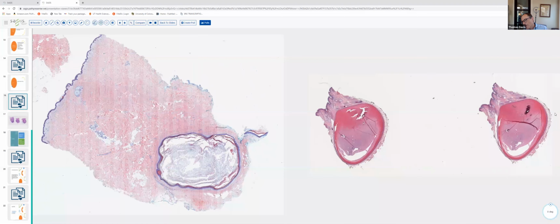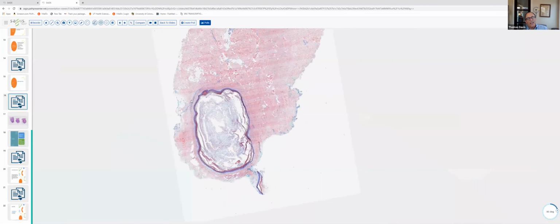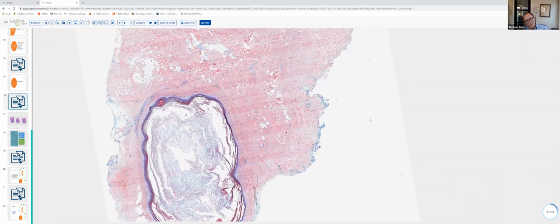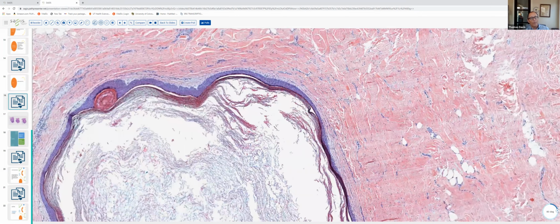On the left, we have a follicular cyst of the infundibular type, also commonly known in clinical practice as an EIC or epidermal inclusion cyst. Now, most EICs are derived from infundibular epithelium. They don't represent true implantation of the epidermis into the dermis. That does occur in surgical sites and sometimes on volar sites. But most of these are believed to be derived from follicular infundibulum.